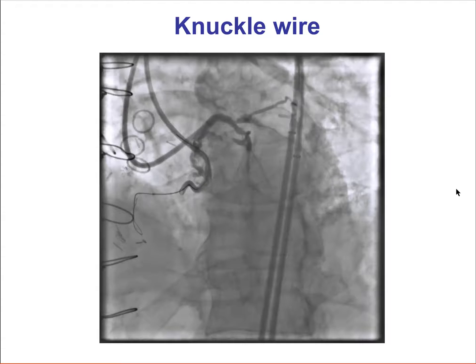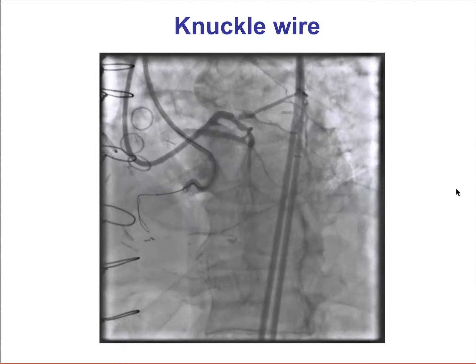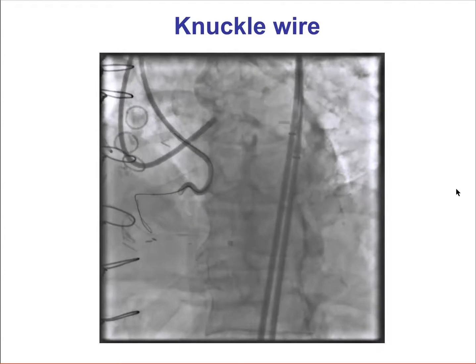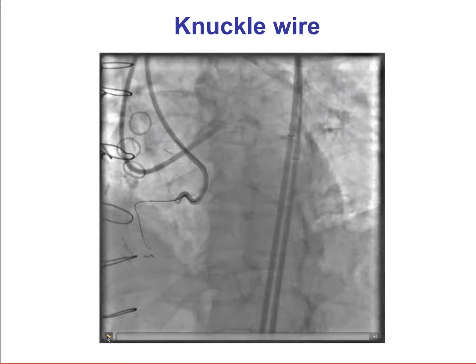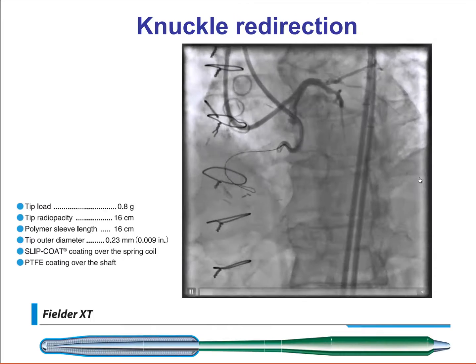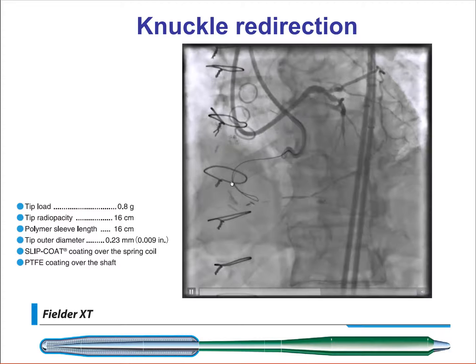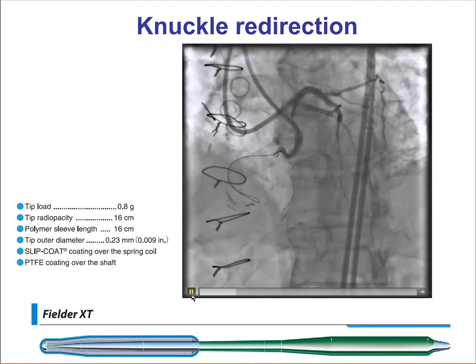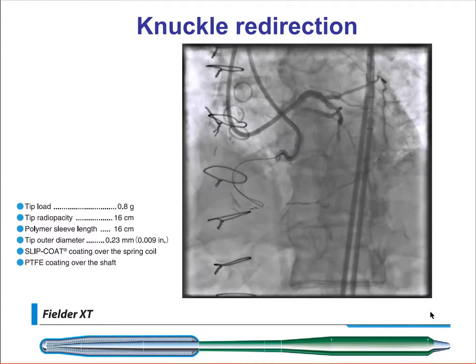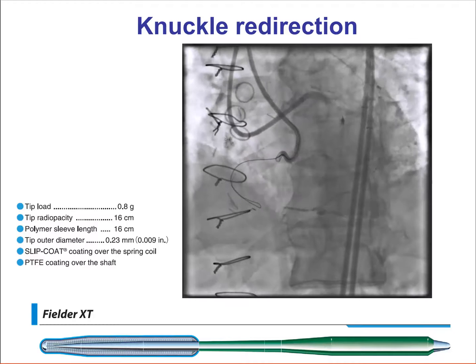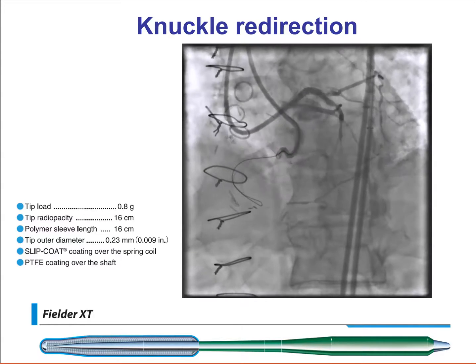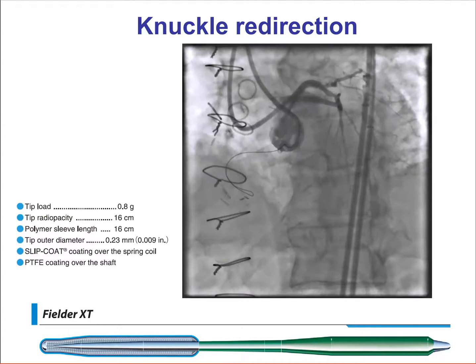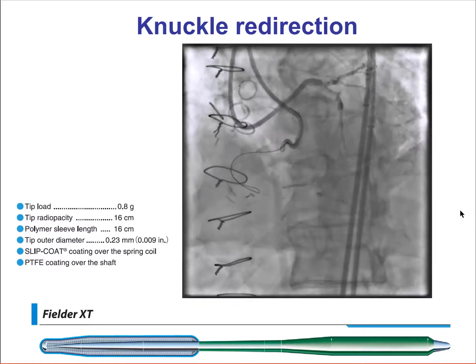We then used a knuckle wire — a Fielder XT guidewire — to bypass that side branch and advance into the distal vessel. After further redirection, we were able to advance the knuckle around the right coronary artery into the distal portion. The Fielder XT wire is the preferred wire for knuckling because it has a soft tip that forms very tight knuckles, and also has a 16 centimeter radiopaque tip, which facilitates visualization of the guidewire in the distal vessel.